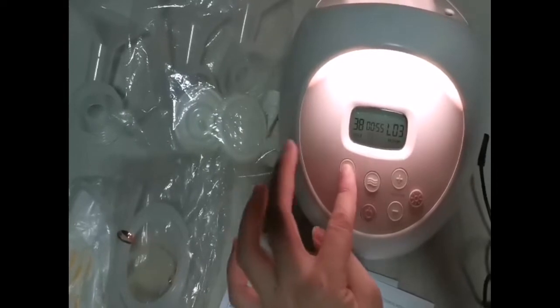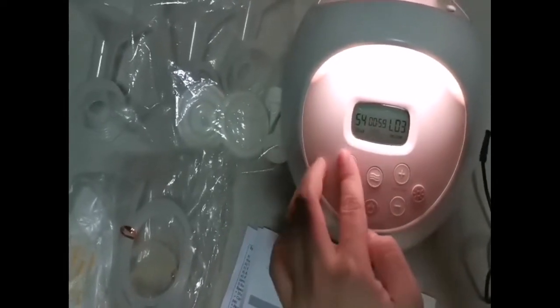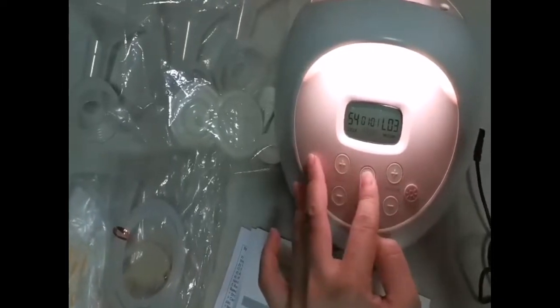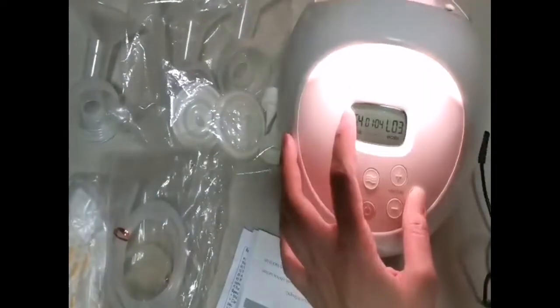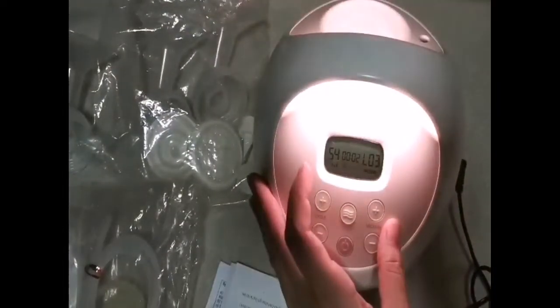This breast pump is really good because it mimics the suction of your baby, and at the same time it's hospital grade. It's really reliable and very durable.